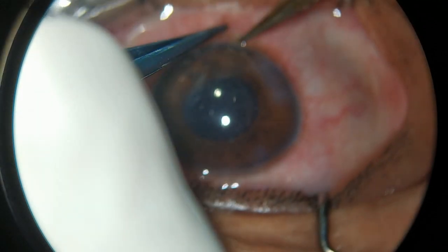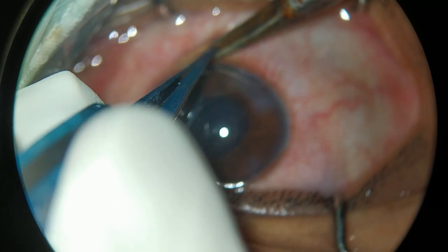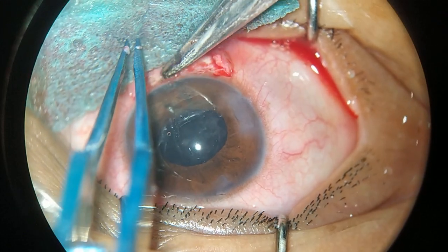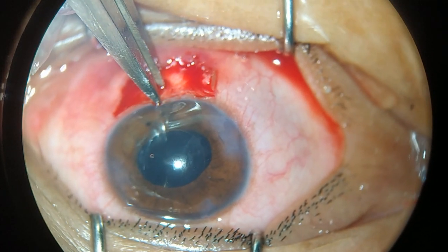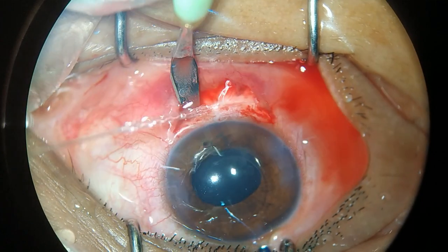Peritomy is done to expose the sclera adjacent to the iridodialysis area. Light cautery is done on the sclera and a scleral tunnel is constructed 2 mm away, parallel to the limbus.